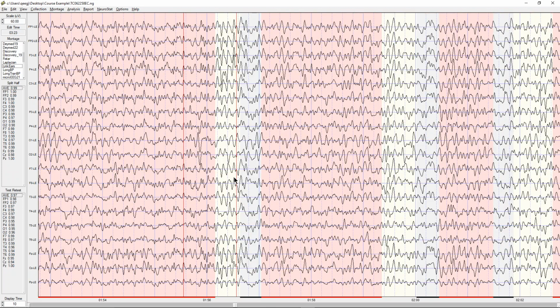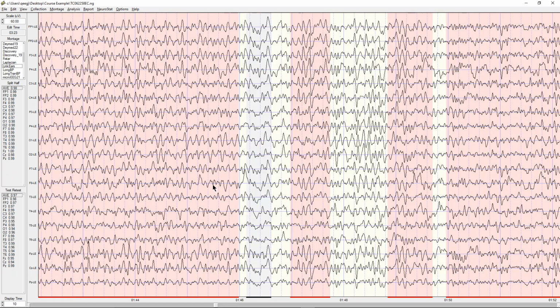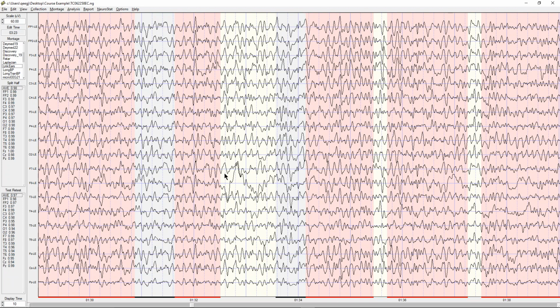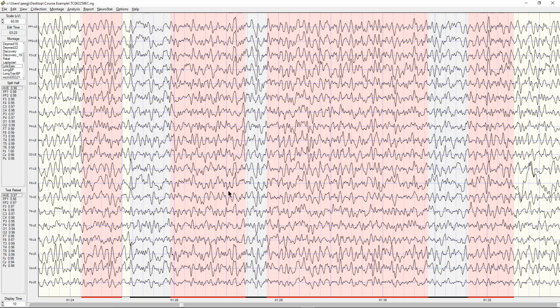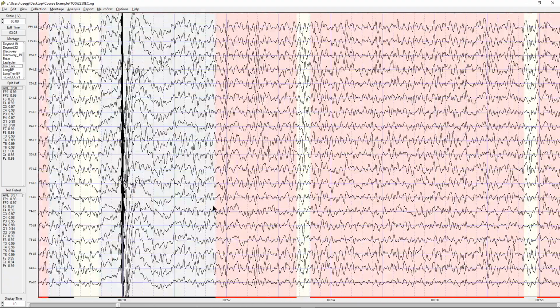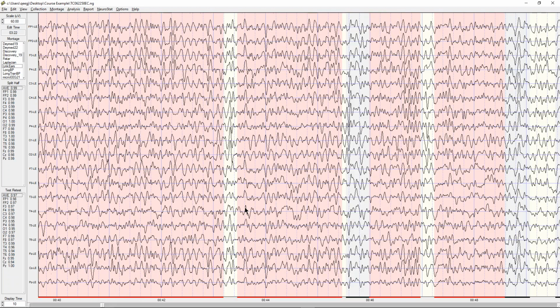Some of it may be rhythmic delta. So we don't want to get rid of something that's real EEG activity. But for example, I've got to think that that's F8, so it's some sort of a little twitchy eye movement going on there. So we're running through this, visually inspecting, trying to pick out the good data and get rid of the bad data.